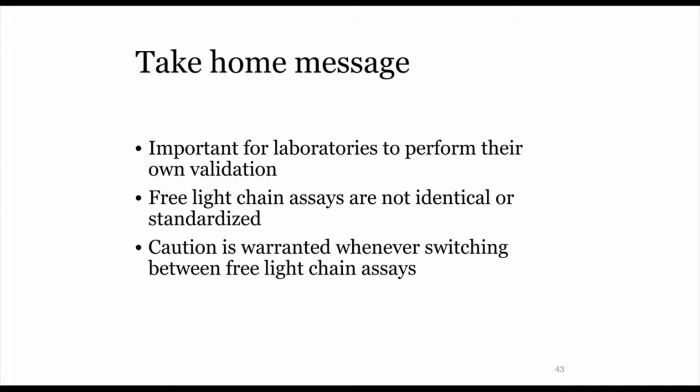But the one thing I want to add is that as a major cancer center, we did a fairly extensive evaluation of both healthy donors and patients with monoclonal gammopathies. And so we believe that it's a lot more thorough than what they did, which is just simply see if the values were relatively similar. We did an analysis including the ratios and the clinical significance.